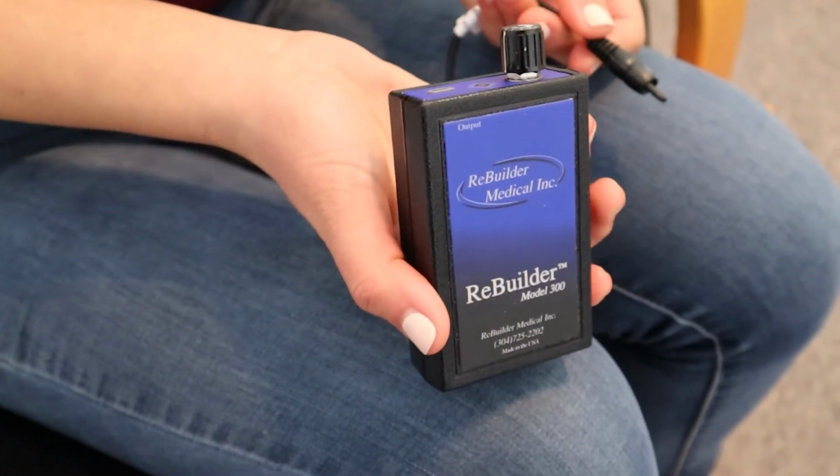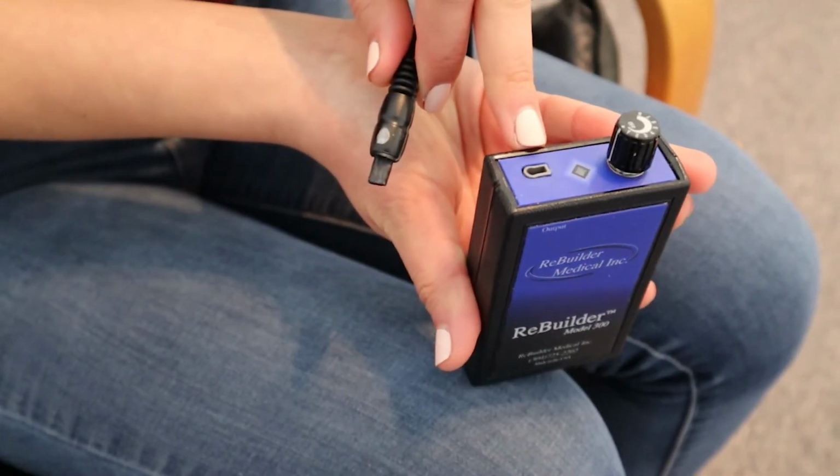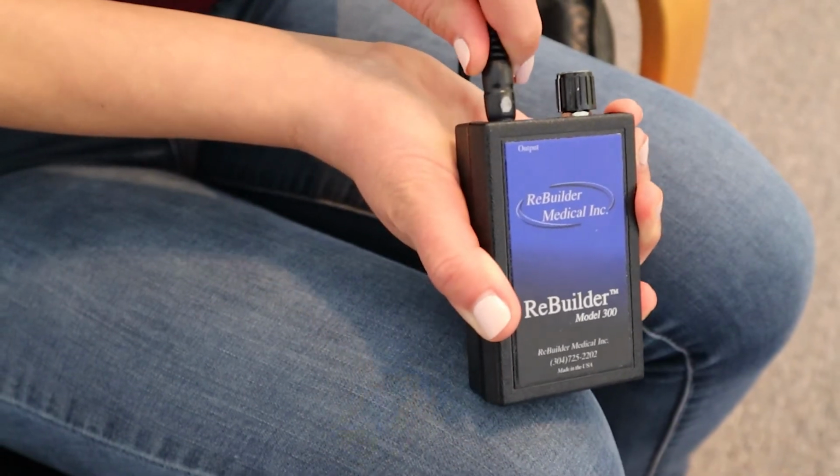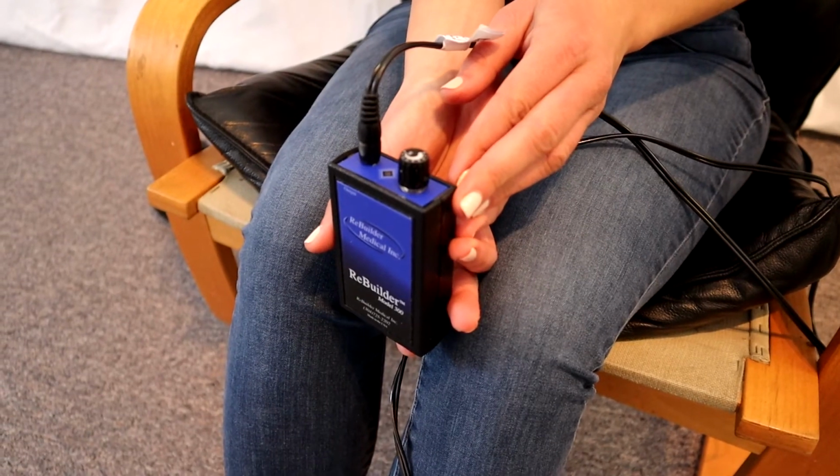If not connected, connect the lead wire to your ReBuilder, and either model ReBuilder can be used for treatment with the conductive socks. Refer to the instructions for treatment information.